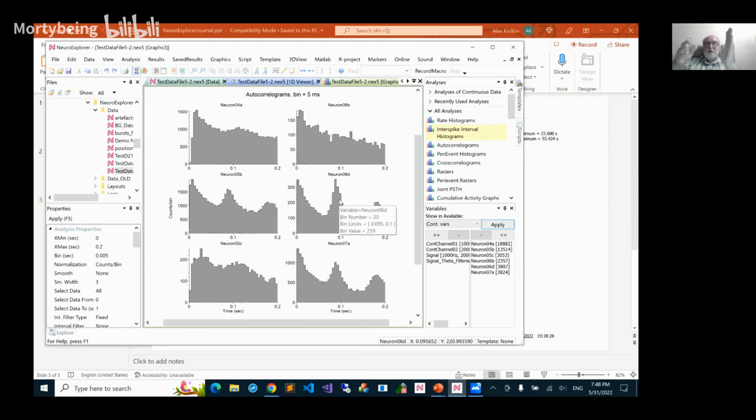As for what a correlogram is, I need to send you a link to the explanation. But the idea is that you have a spike train, and you look from the top and align your eye with one of the spikes, and then you look left and right, and you have these little bins.